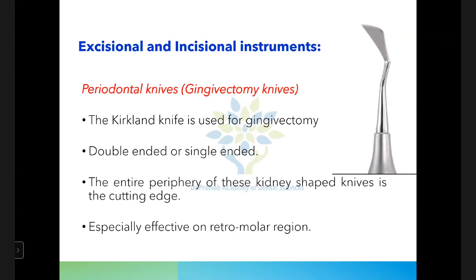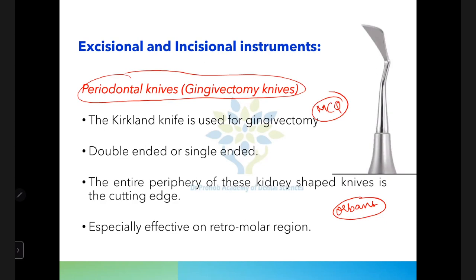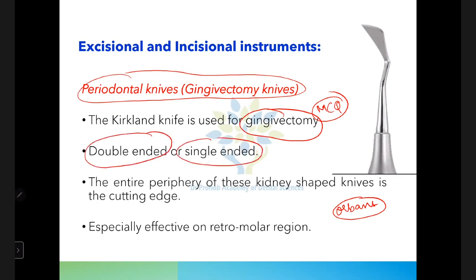Starting with excisional and incisional instruments — these are used for excising tissue and giving incisions. First are the periodontal knives, also called gingivectomy knives. An important MCQ point: Kirkland knife and Orban's knife are the two main knives used for gingivectomy.